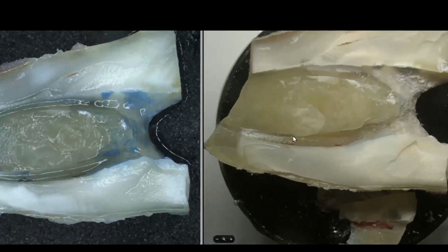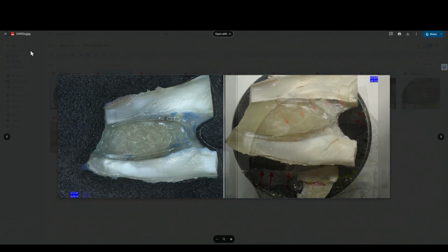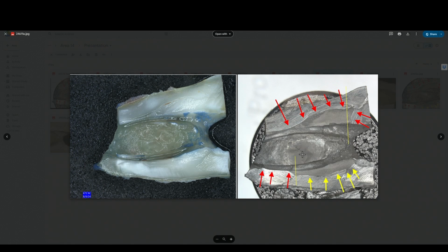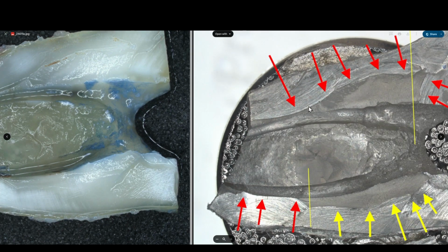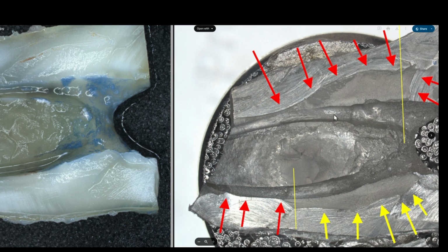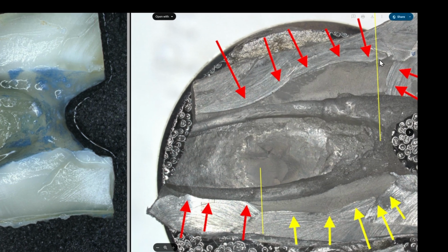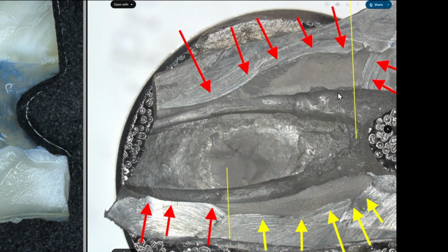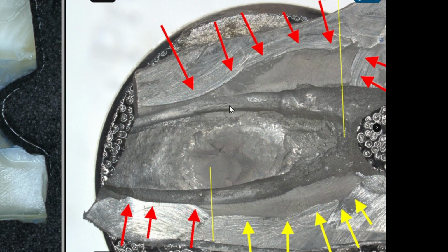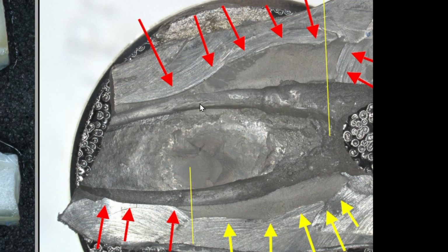We're trying to figure out where the virgin canal is, so you get a sense of what the irrigation device does. I like to look at the sputter-coated sections, and you'll notice I always show them, because when you look at them, it's really obvious where the sectioning disc went. So when you look at this area, this canal is a virgin irrigated canal right up to where the yellow line is. Here you can see the sectioning disc. This area will have some sectioning debris, but this area is virgin canal and probably represents what the canal actually looked like after the irrigation device was used.